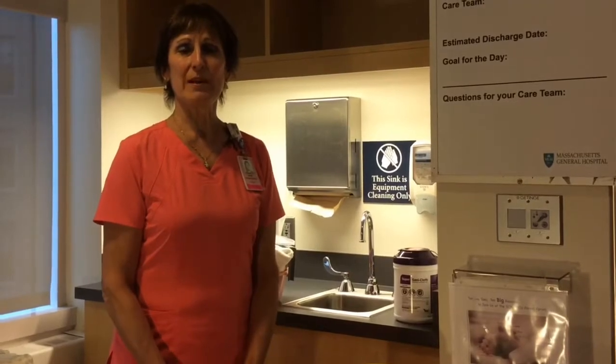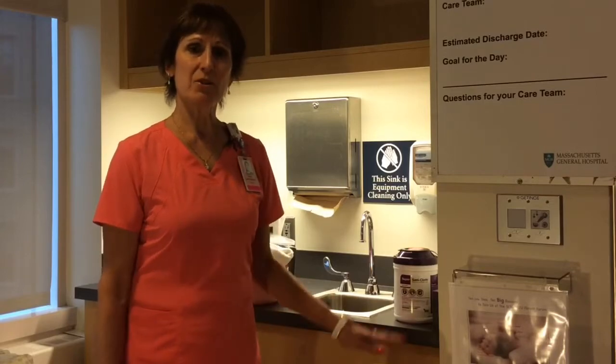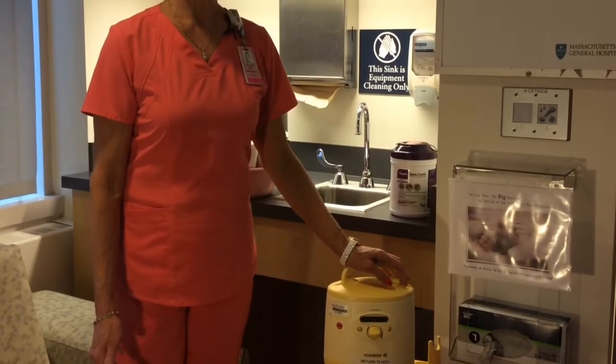Hi, I'm Susan Warden. I'm a NICU nurse and lactation consultant in Mass General Newborn Intensive Care Unit. Today I'm going to show you how to use the Medela Symphony Pump.